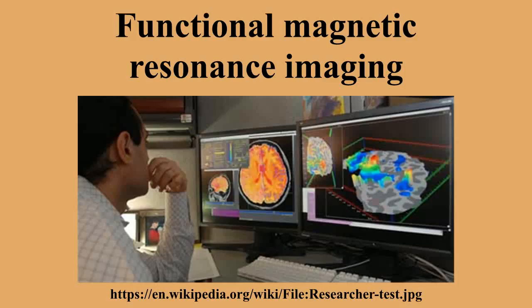The magnetic fields, pulse sequences, procedures and techniques used by these early studies are still used in current-day fMRI studies, but today researchers typically collect data from more slices and pre-process and analyze data using statistical techniques.